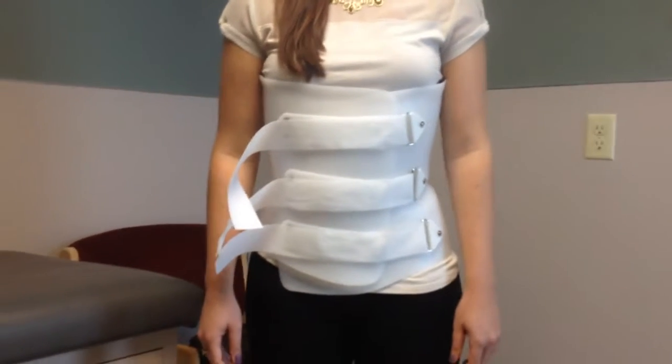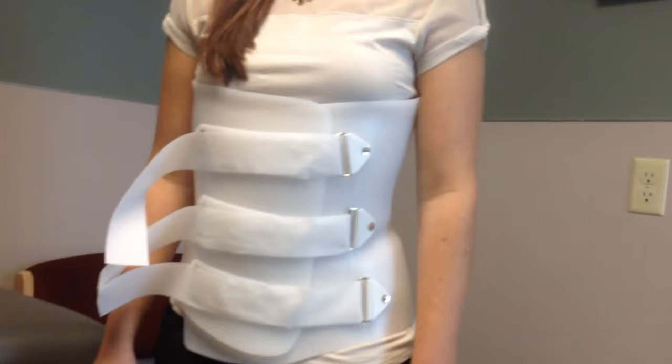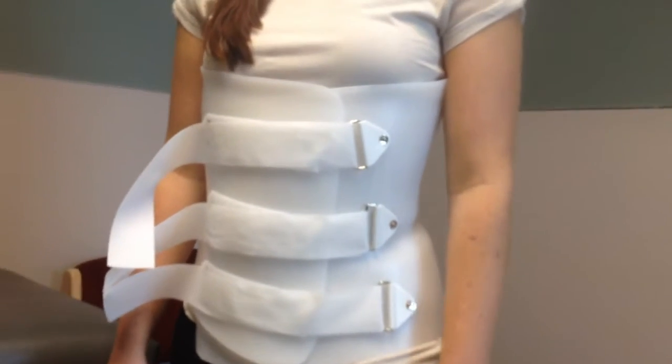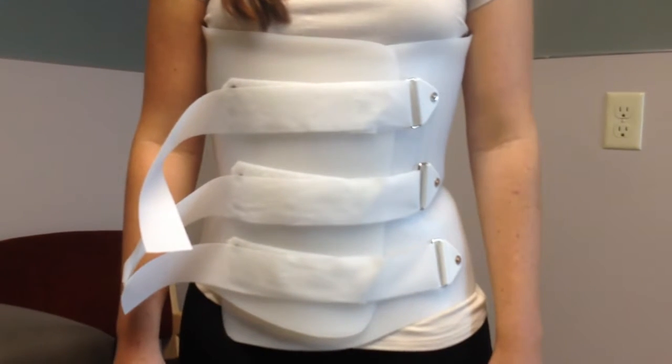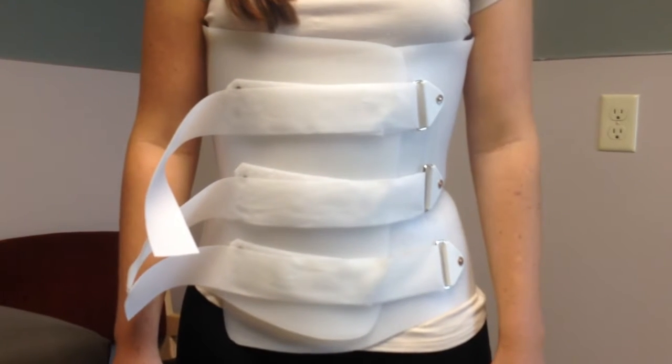This one was not made for my model, that's why it doesn't look like a very good fit, but it's hard plastic and it really restricts a lot of motion in lots of different planes of motion.